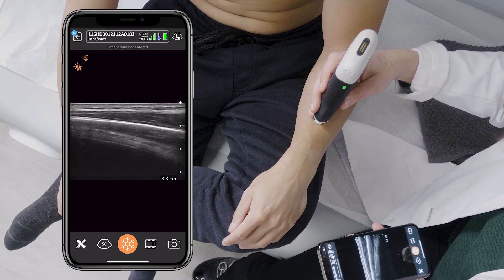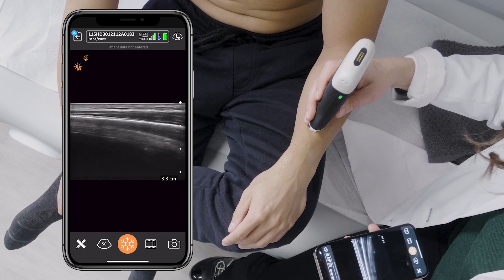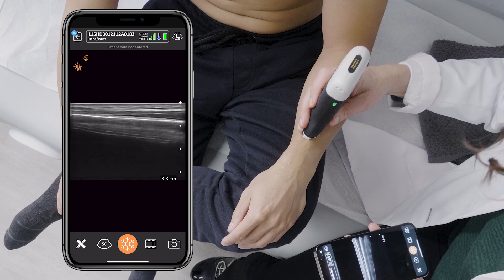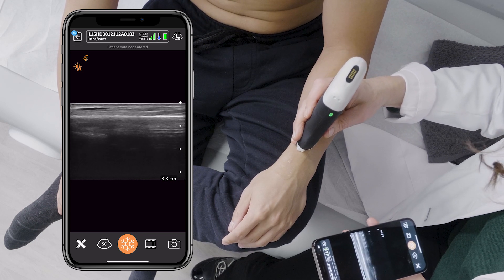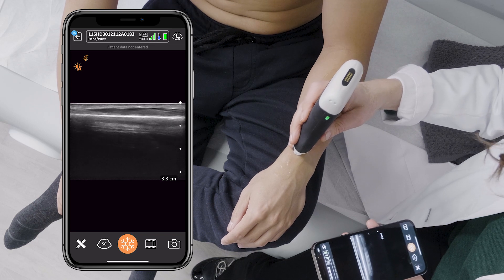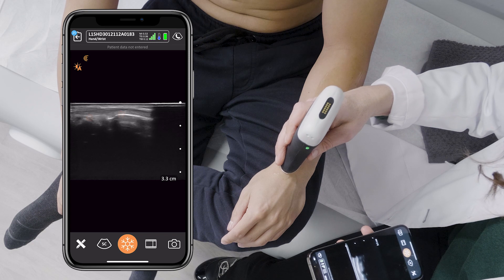So with my linear probe, I can identify the distal radius as that bright white line and I follow that bright white line all the way until I reach the radial carpal joint. Most fractures occur in the distal radius right here, but I will continue my scan and my investigation until I see that joint.